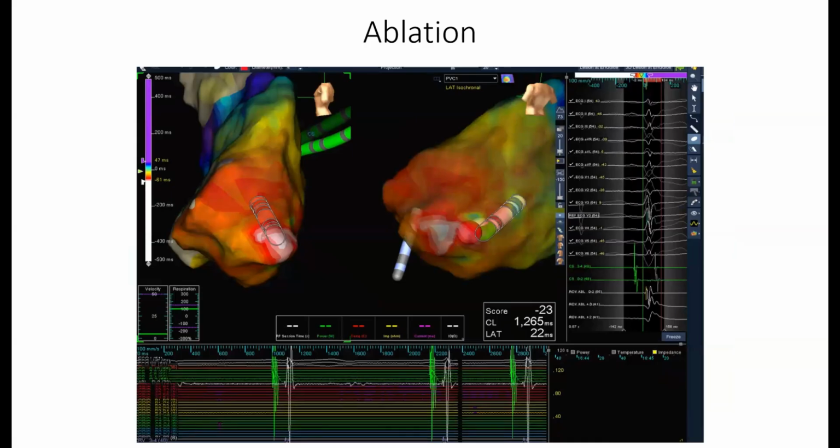On the left side of the map, there's another white spot in the front. There are two white spots. Can you see it? On the left map, there's the front aspect, a lateral wall. You're taking the posterior septum there, the anterior septum. Move the arrow to the anterior septum, and there is another white color there.